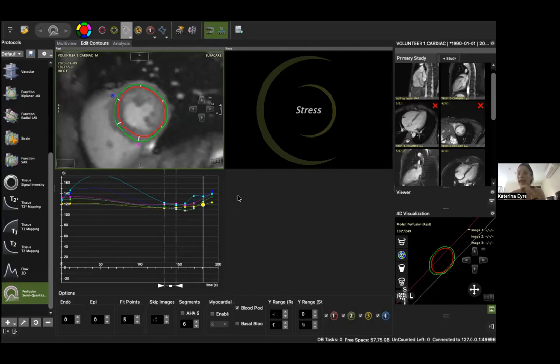And now with the newer analysis that we're testing and validating, we do normalize some of the signal intensity changes that we get to a cohort of normal values that we've obtained at McGill. But usually when we go to new centers, we first see if the normal values that we measure there are similar to the ones we initially used to evaluate at McGill.